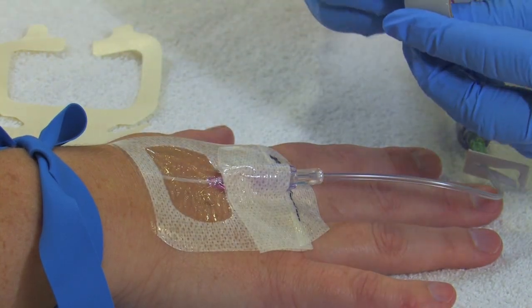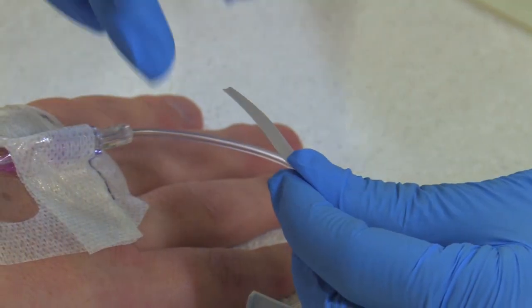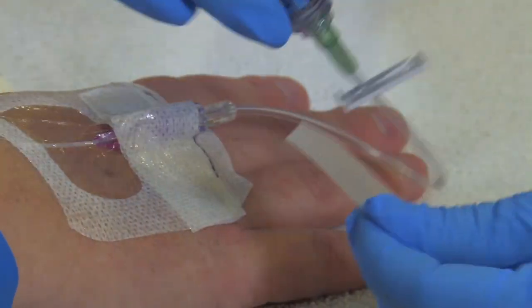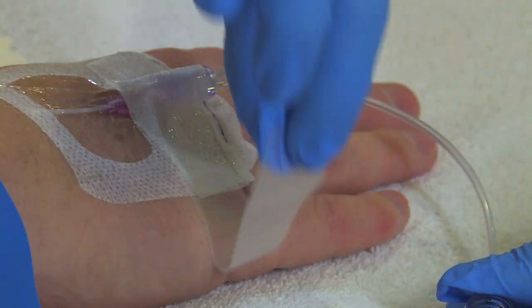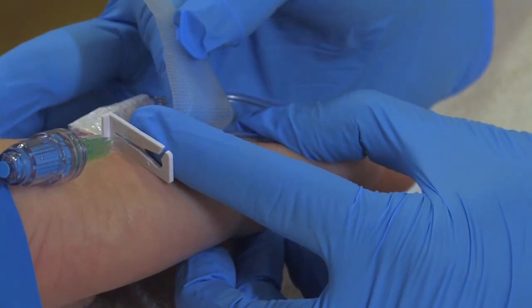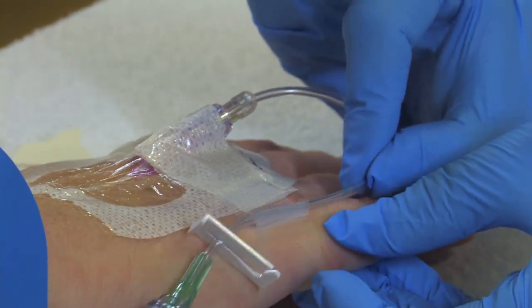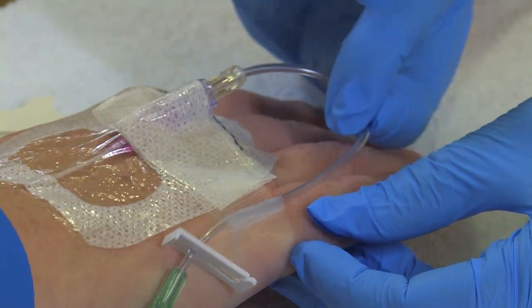Then we want to take our tape and create a J-loop. We want to make an omega loop of tape, and that's why it was so important to clean outside the barrier of the window, because we want to make sure that this tape adheres well to the patient's skin. So we're going to put it down facing away from the patient. We're going to pull it back a little so that the sticky side is up. We're going to place the catheter, and then we're going to flip the tape back over so that the tape is covering the catheter. And we're going to tape it down to the patient's skin so that this omega tape has a little bit of pull force, and so that the catheter is not actually resting on top of the patient's skin. So now it's very secure.